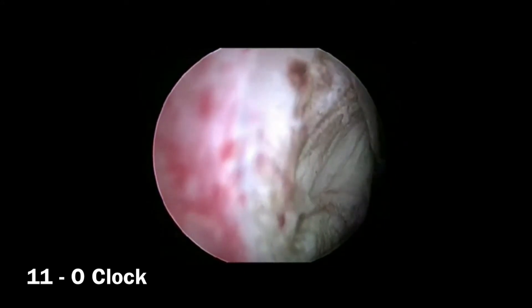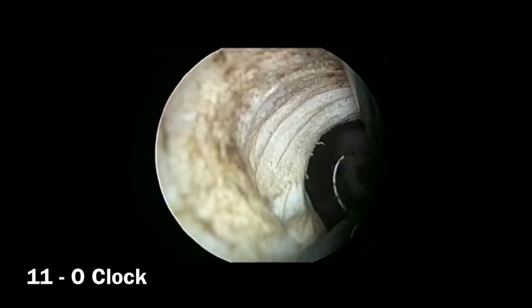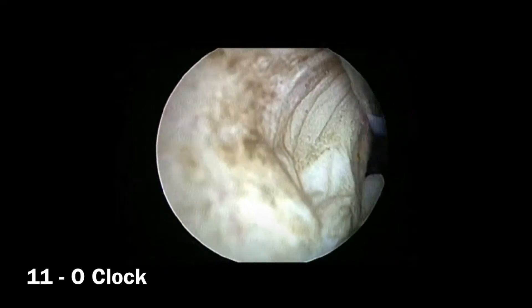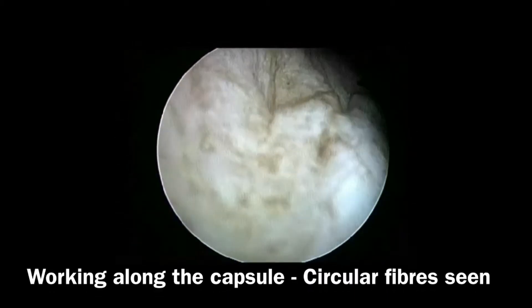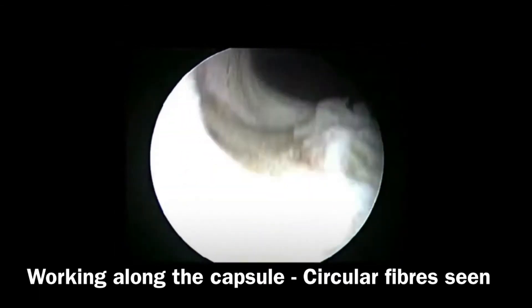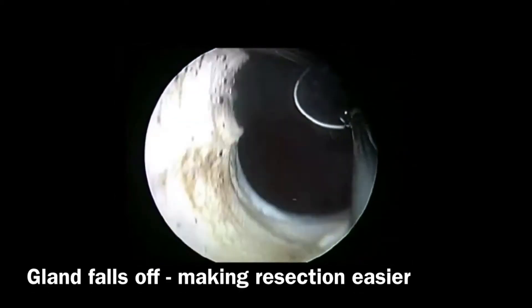The resection is then continued along the capsule beginning at the 11 o'clock position. The advantage of plasma therapy is: first, effective hemostasis is achieved simultaneously during the resection; and second, the utilization of normal saline helps us to avoid dilutional hyponatremia, one of the dreaded complications of TURP.